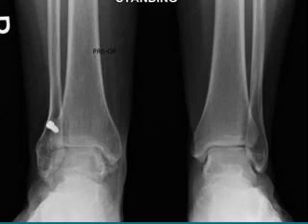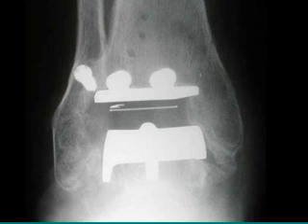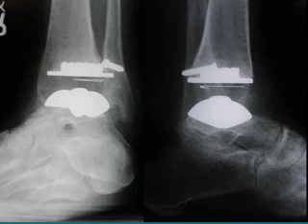Let me show you a patient. This is a very, very narrow, thin patient with a very small intermalleolar distance. She had this prior screw from trauma, and now she's got arthritis in her ankle. Well, her ankle is done, and she has a slight varus position of her tibial plate, probably about 3 degrees. But you can see very readily that the talar component looks like it's impinging on the medial malleolus. Well, I see other x-rays like this, and the patients have no pain. And yet the next person walks in and has exactly the same x-ray and significant pain. But here I think it's clear that she has impingement, and this was an extra small talar component.